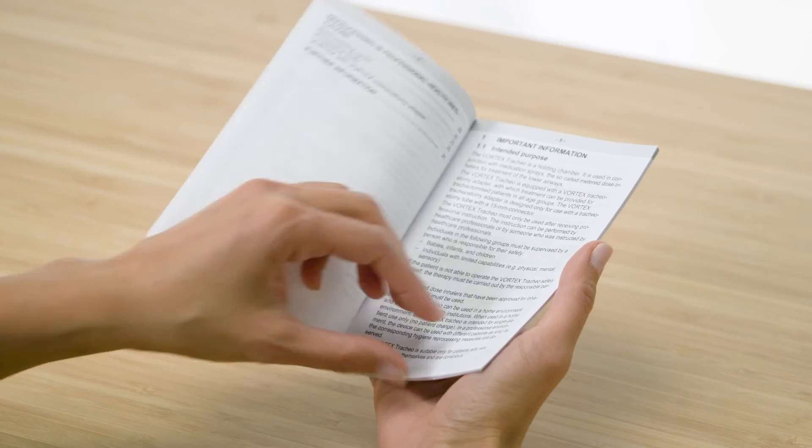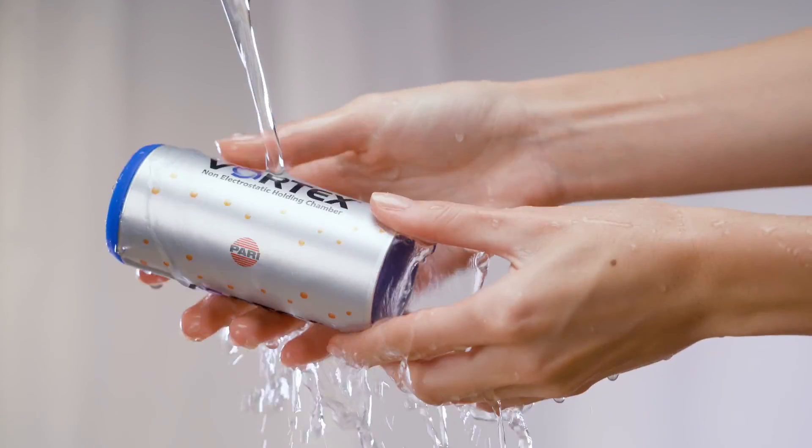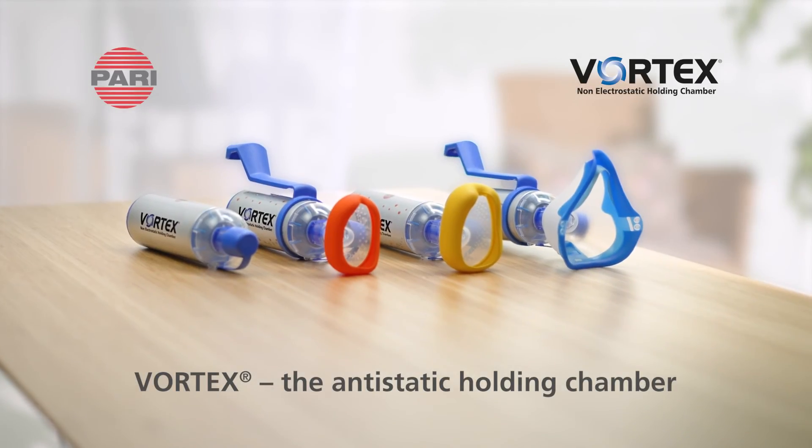Please always observe the instructions for use when using the Vortex. Information on cleaning is available in our cleaning video. Vortex, the anti-static holding chamber.